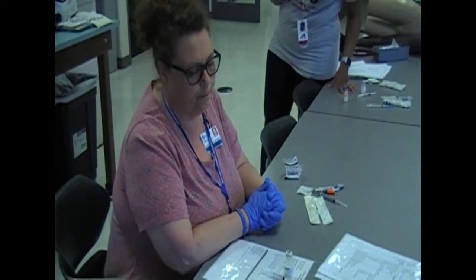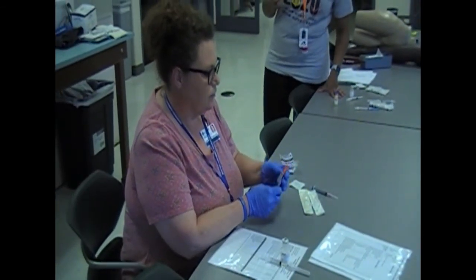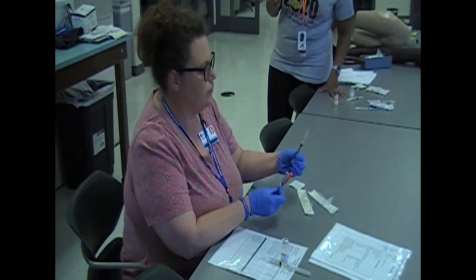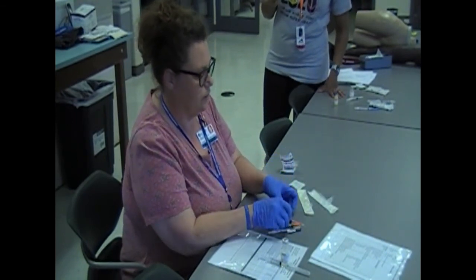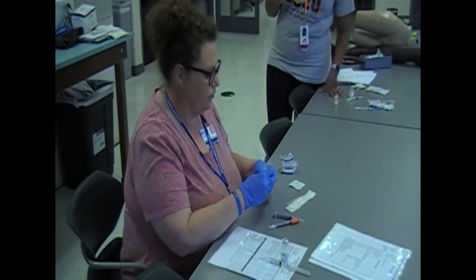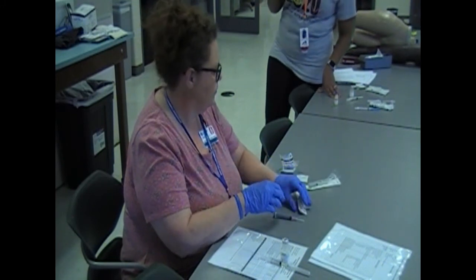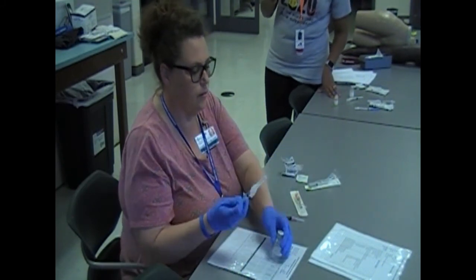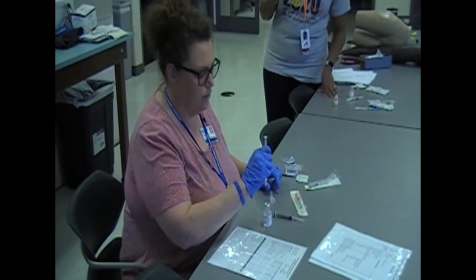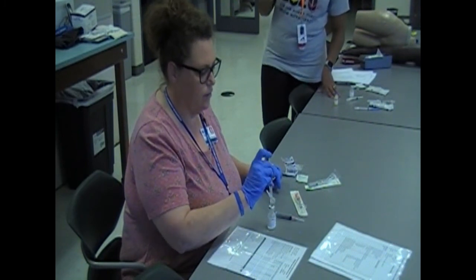Once you have completed that, make sure you show us your syringe so that we can see you had no air bubbles and the correct amount in your video. So you may have to do a close-up shot of that. And then that is when you say you are done, and you can end your video right here for med administration. Okay, we'll come back with part 2.